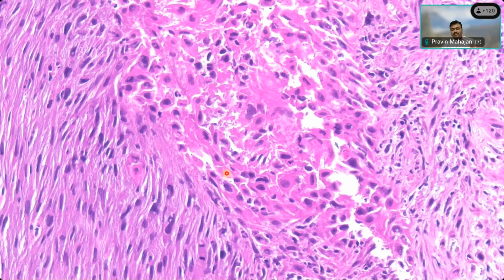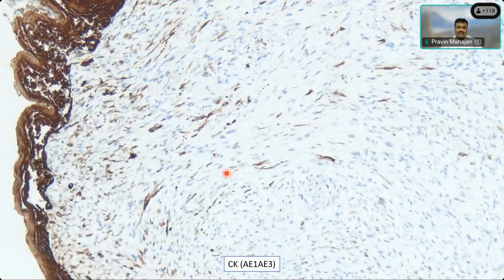But let's say you don't have this, you don't see anything, you have a small biopsy, sometimes you get a punch biopsy and you may not be able to see this epithelial differentiation in the tumor. Then you will go and do the immunohistochemistry. So what immunohistochemistry will you do, Anugrah? You're absolutely right, you want to do immunohistochemistry. But before that, one should actually look for epithelial differentiation by doing serial deep cuts or studying more areas. Okay. So what immunohistochemistry markers would you like to do, Anugrah?